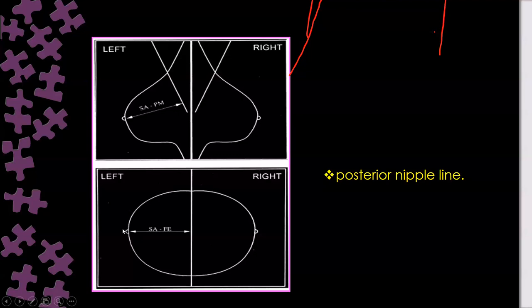Here, with an optimum CC, the nipple central in profile pointing straight forward, and the central pectoralis muscle visible, I could confidently measure the posterior nipple line, then I can use it as a reference to match with the other view. And if there is a mismatch in this case, then I will consider the MLO is not optimum and I will repeat it.